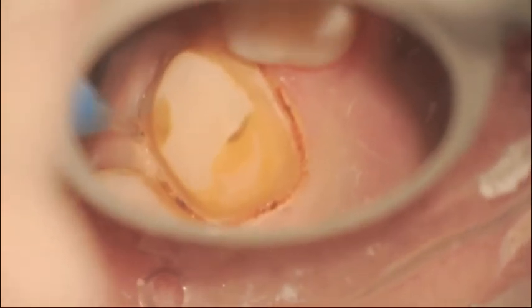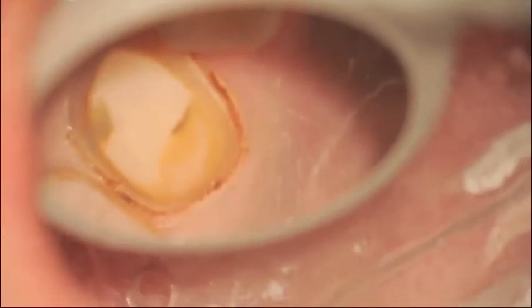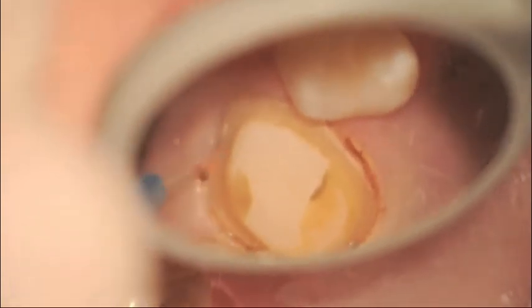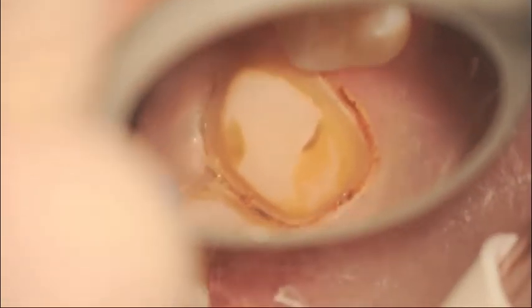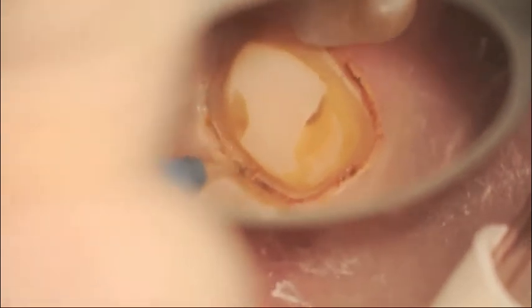If you notice a little bit of charring, you should lower your energy settings. In this case, you can see that there's not a lot of charring occurring. We're progressively moving circumferentially around the tooth, constantly angling towards the tooth, and every time that a small amount of debris picks up on the tip, we stop and remove it with the wet gauze.